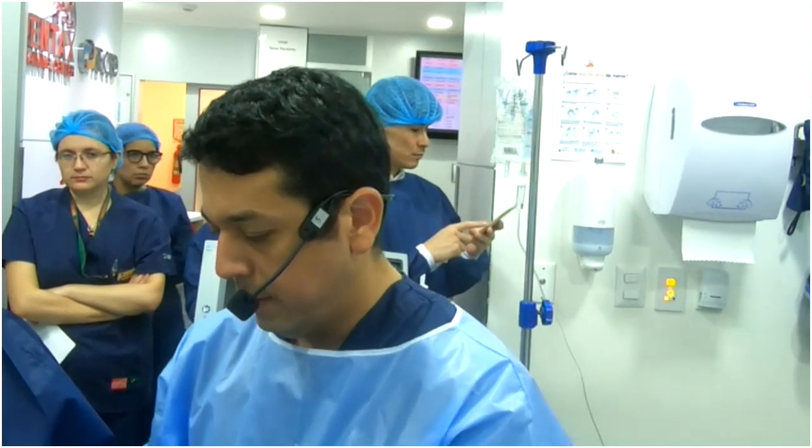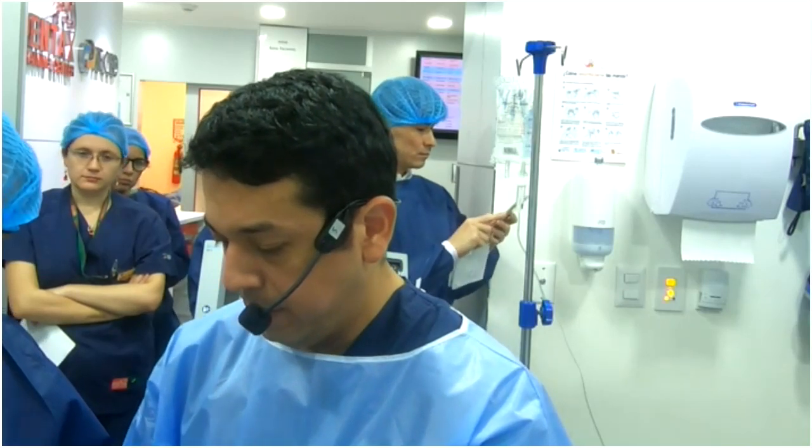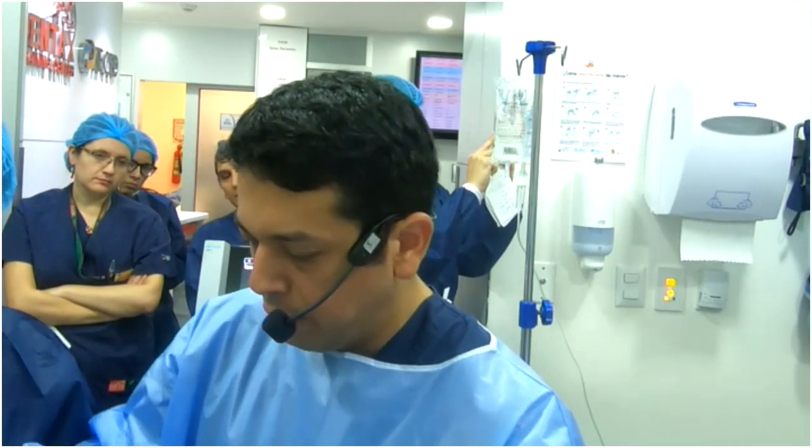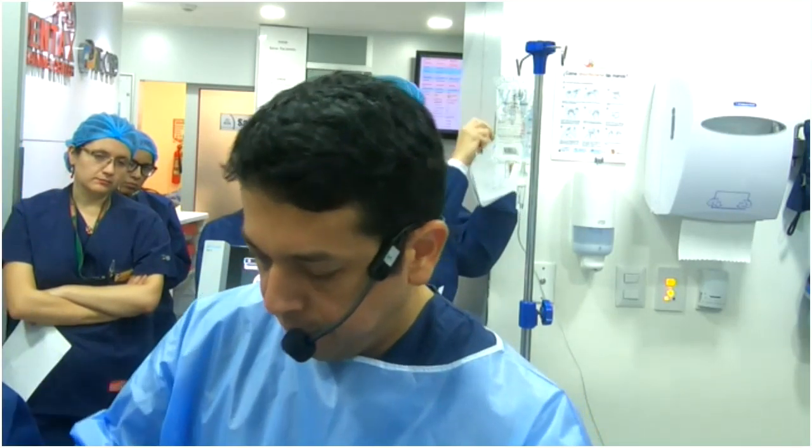Perfect. Now we pass this as a ligation kit, just in the middle.